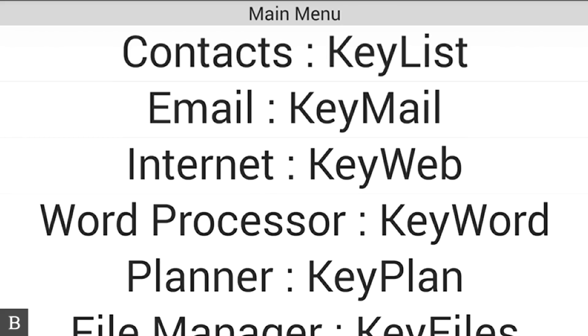In this case, I'm going to update our shopping list Google Doc from my BrailleNote Touch.